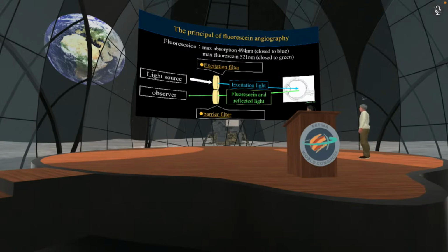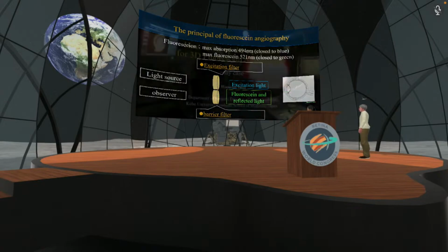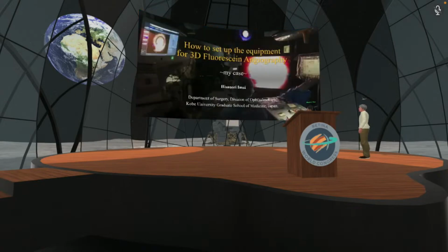So today I present how to set up the equipment for 3DFA in Kobe University. So next please.